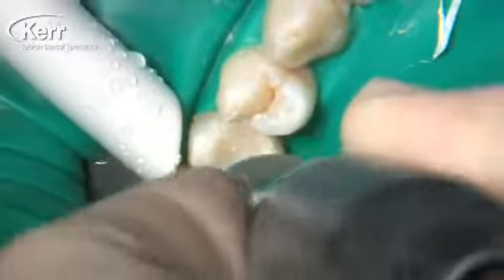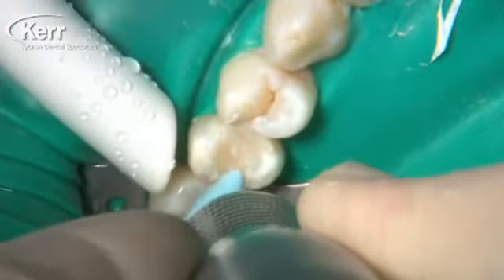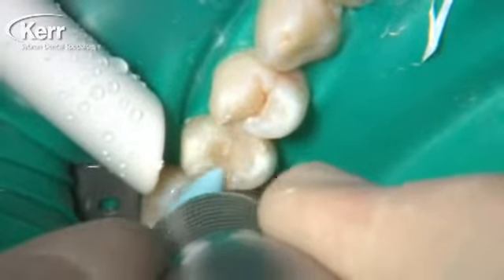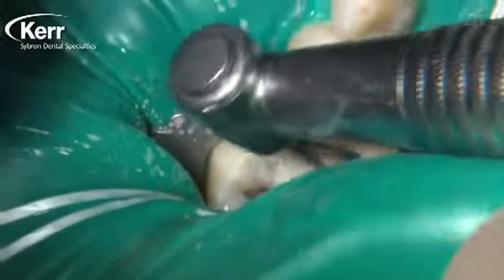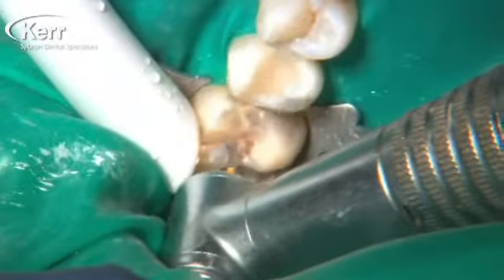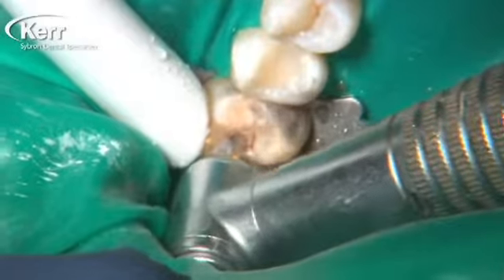The composite is cured. We use a 7408 bur to do any shaping needed and clean up the margin, then use the high luster points to polish it up to a high shine. For the interproximal box, we use the Opti Disc to finish that. The composite is finished.